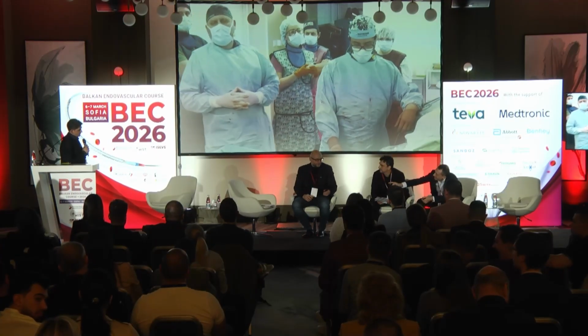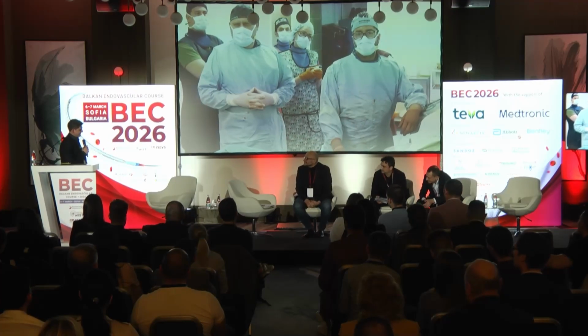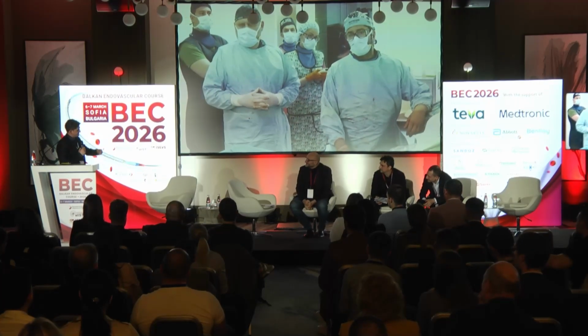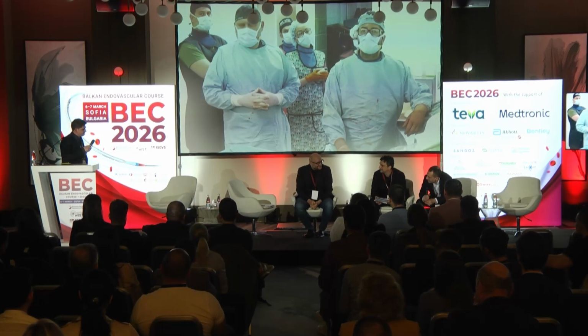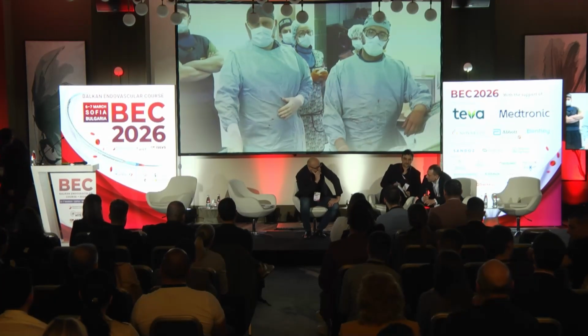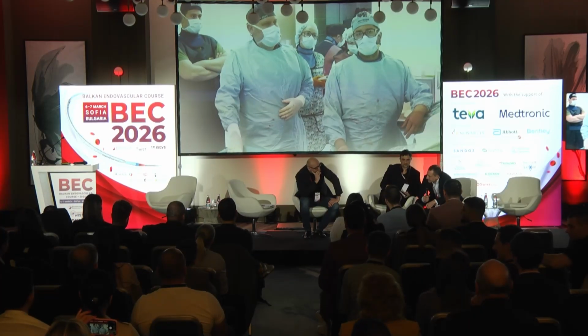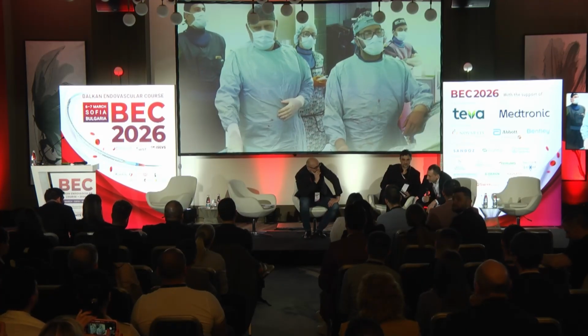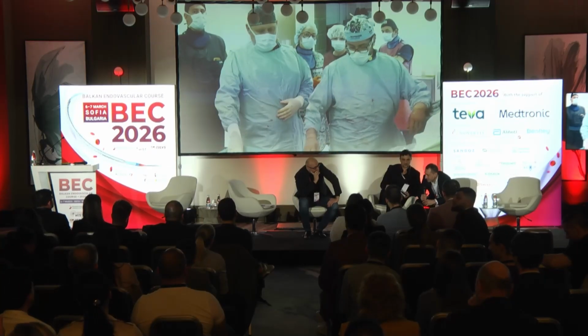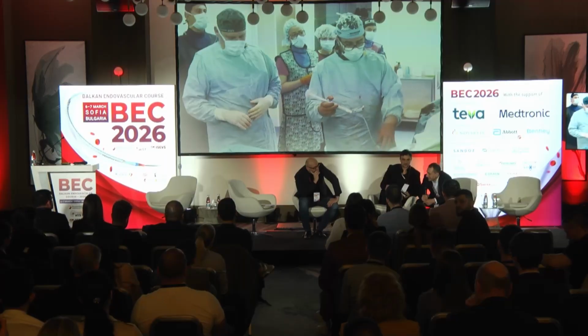Venovo stents are nice. My boss will tell you more about the choosing of the stents because it's his presentation actually. Nowadays it's a question of money. We still have only the Wallstent reimbursed in our country, and all the other stents are too expensive. Some patients can afford these expensive stents, and in any case we can use Venovo or Abre.